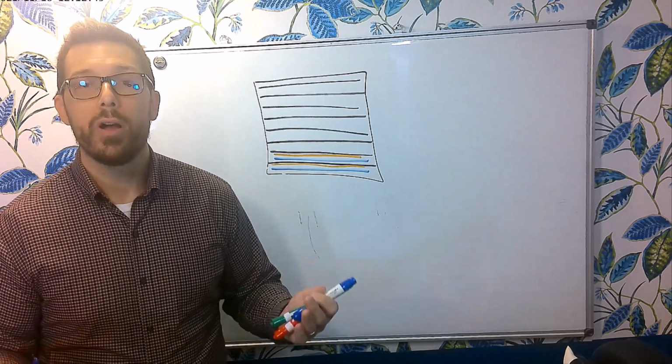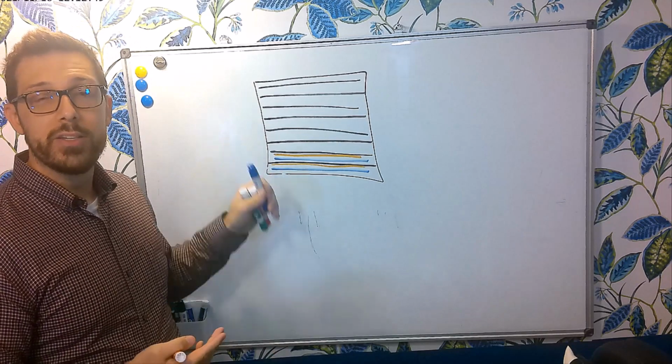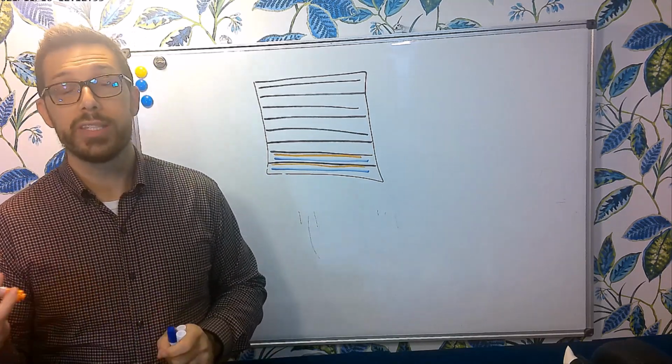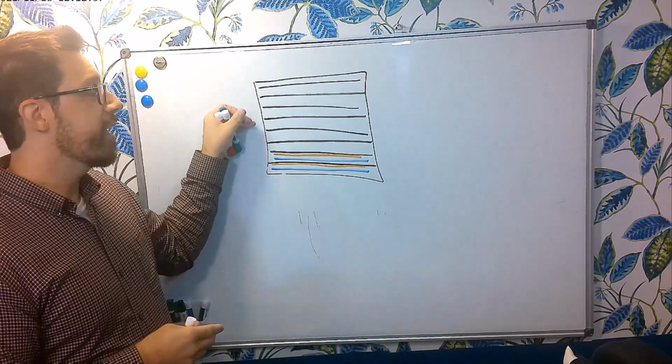And then we average those signals together to produce a higher signal-to-noise ratio. However, we're going to also increase our scan time because we're collecting this data twice. So we're going to increase our scan time as well. So we have an increase in signal-to-noise ratio and an increase in scan time as we fill this K-space.